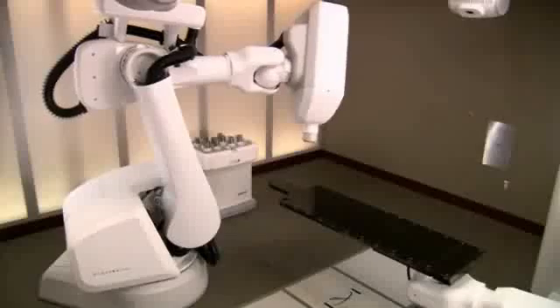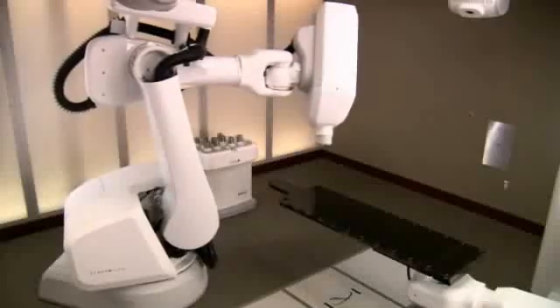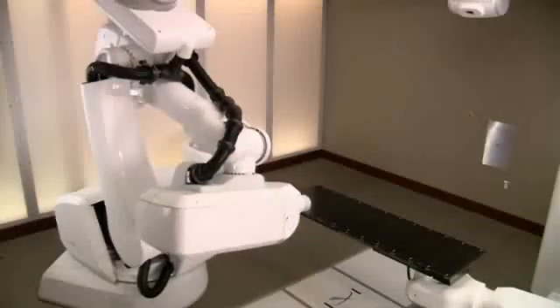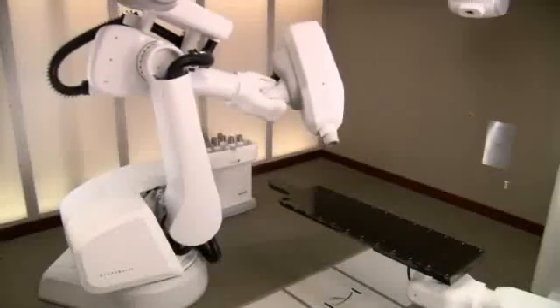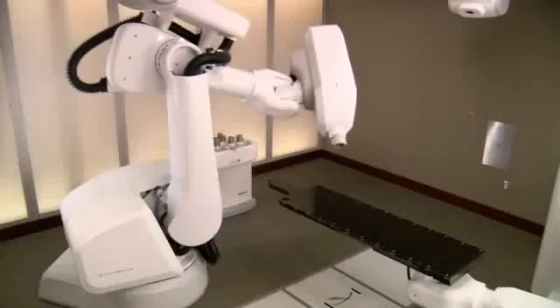It relies on robotics and sophisticated image guidance technologies to attack tumors with extreme precision. The flexibility of the robotic arm enables your doctor to deliver multiple beams of high-dose radiation directly to your tumor from almost any angle, while minimizing damage to surrounding healthy tissue and critical structures.